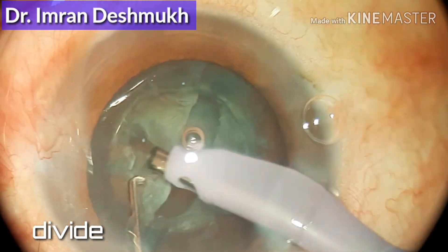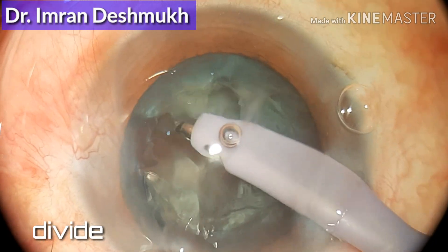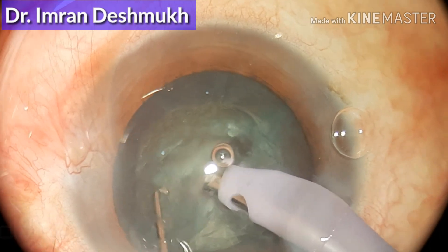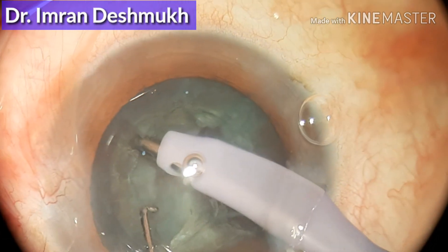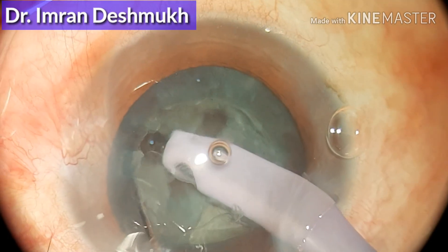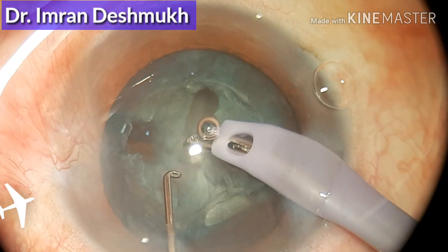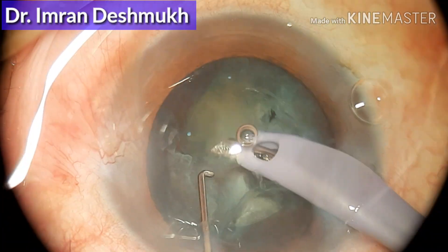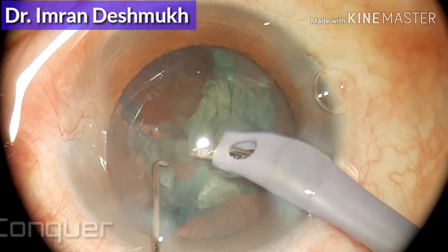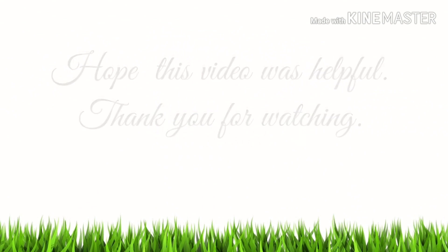I already made two halves, and now I'm trenching one of those halves to make two more pieces — so right now I have three pieces. Now trenching one more to complete the quadrants. I have now divided the nucleus into four equal quadrants, more like four pieces. You're supposed to grab each quadrant and start emulsifying them. I hope this video was helpful — thank you very much.